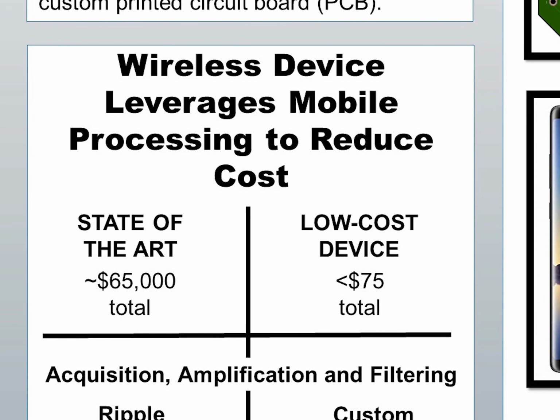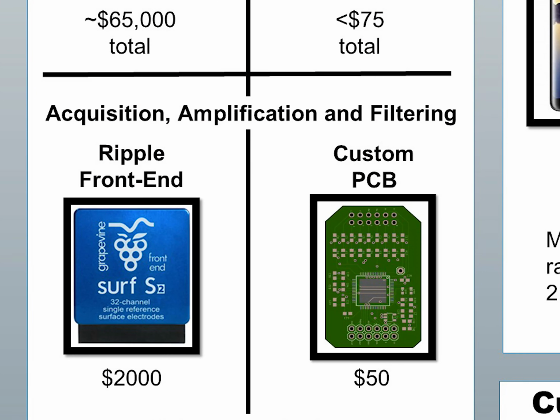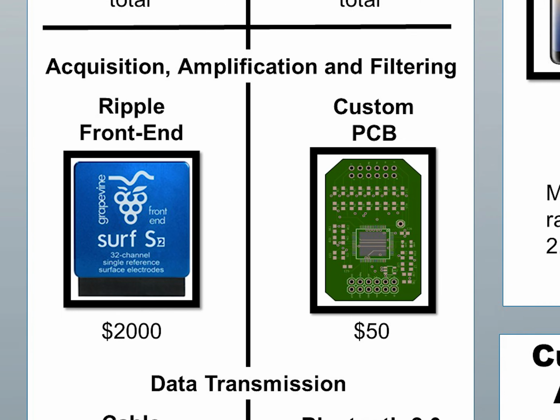Currently, the state-of-the-art system costs around $65,000, and the goal of this project is to get one costing under about $75. On the left, you see the Ripple front end, which is responsible for taking in the EMG data from electrodes and doing some basic filtering of that data, and it costs about $2,000. On the right, the new system's version, which is a custom circuit board designed to also take in EMG data from electrodes, costs about $50.